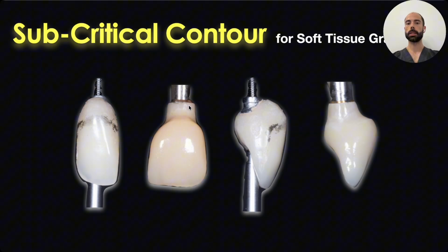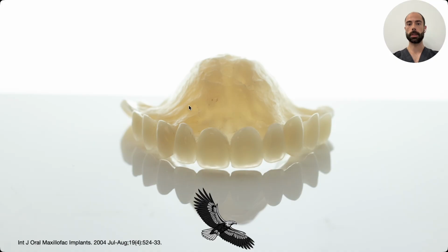Here you can see clearly the difference between an over-contoured profile, the red line, and the correctly designed subcritical zone, the green line. And you can see that the red profile compresses the graft, compromises vascularity, and risks necrosis or resorption. The green profile creates a protected space for the tissue to integrate and volumize. This is not just aesthetics, it's biology.